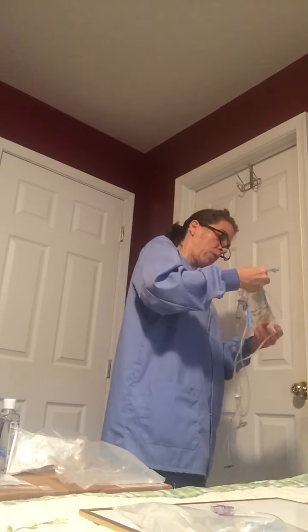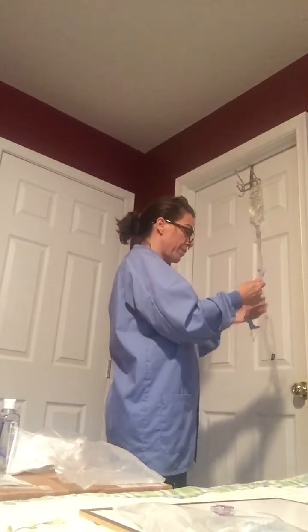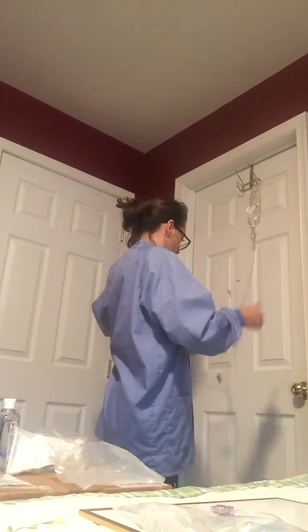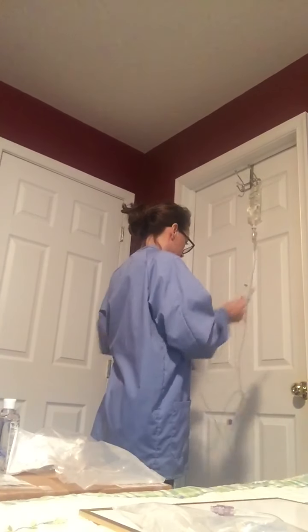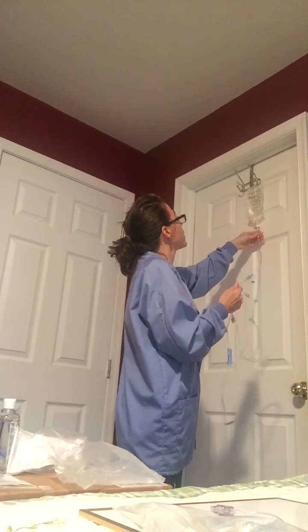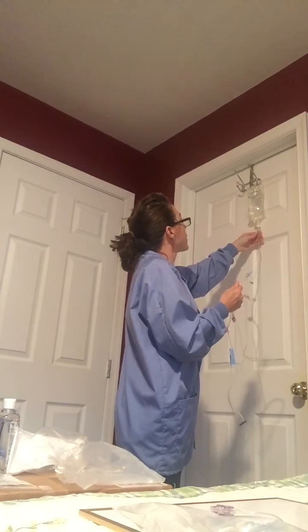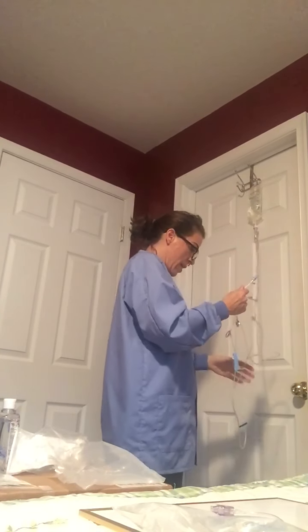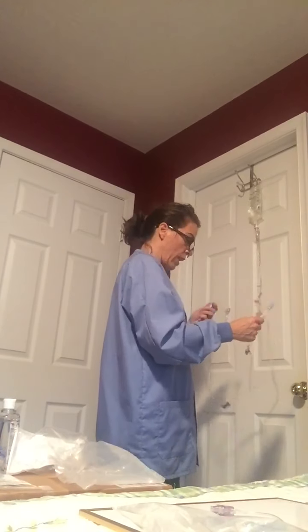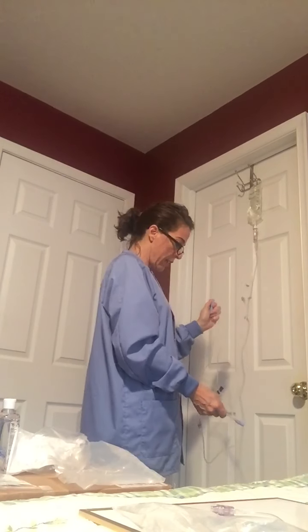I'm going to hang up my IV bag, and I'm going to prime the tubing. But first, let me untangle myself here. I'm going to depress the drip chamber and fill it about halfway. Okay, and then I am going to slowly open the roller clip, or roll it down, and prime the tubing.